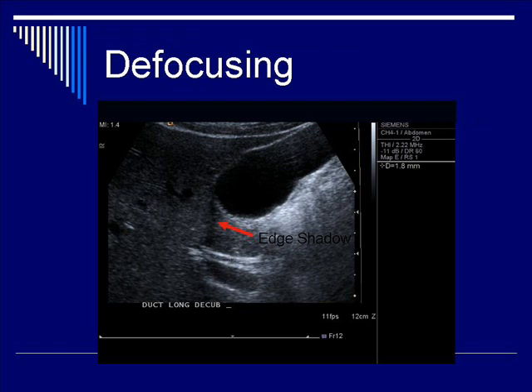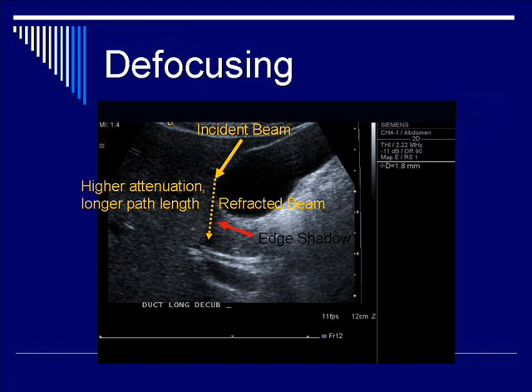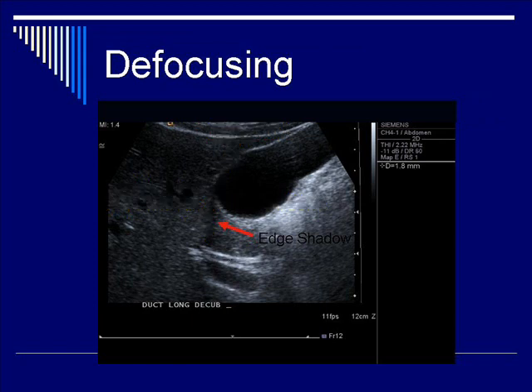Here the gallbladder edge has a dark line distal to the curved surface, as pointed out by the arrow. Reconstructing the mechanism: an incident beam from the transducer traverses the path outlined by the yellow line, hits the curved surface of the gallbladder, becomes refracted, and loses much of its signal. When the signal returns to the transducer for decoding, the higher attenuation due to the extra-long path length traversed by the ultrasound wave produces much less signal than surrounding regions, giving you the dark anechoic shadow known as defocusing. This is a beautiful picture of the gallbladder, with the bile duct visible distal to it.